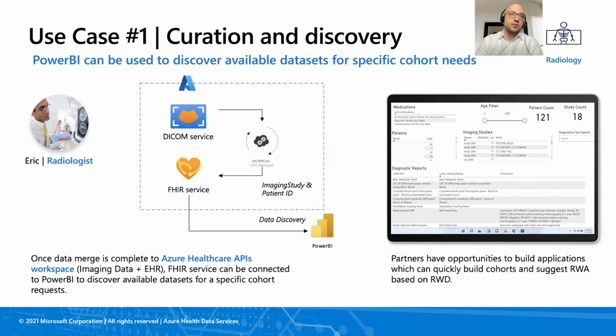And from here, based on the filters that you set up in Power BI, the tumor board can go ahead and search, saying, hey, give me all the images of the patients who are women in this age range, taking that medication. And from there, a tumor board can have access to a cohort that can be exported for their further analysis to make the best decision regarding how they want to proceed with Mary's case.